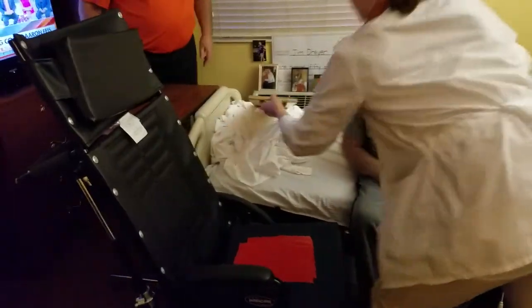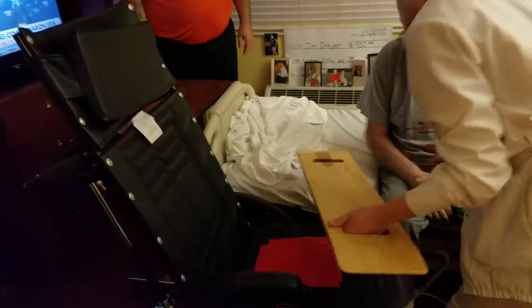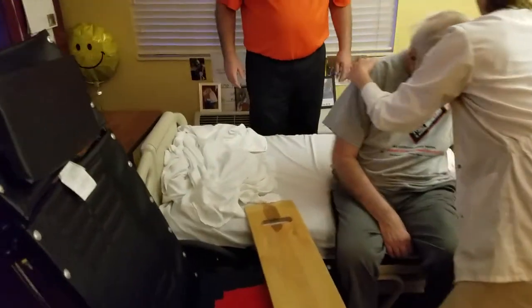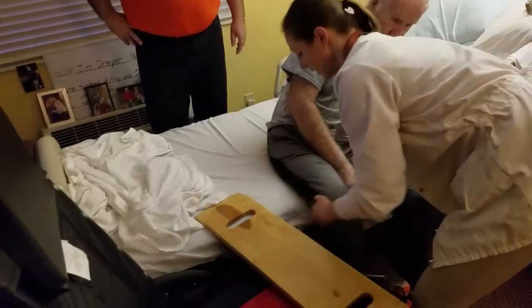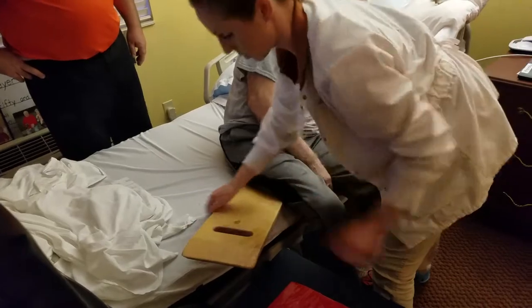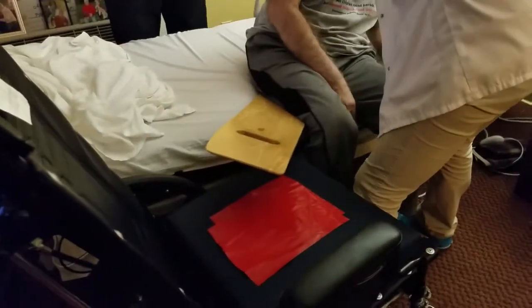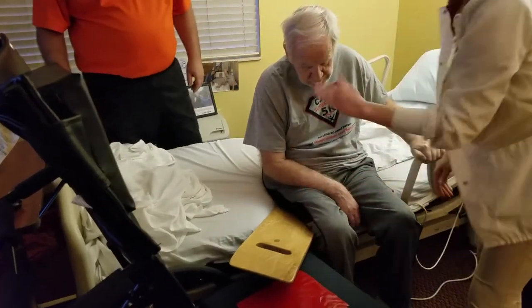Now it's time to put the board under. The board needs to be in this position, sliding it down like that. Mr. Dreyer, I need you to go back down on your elbow — all the way on your elbow. With him in that position, get some weight shifted, then you can pick his leg up and slide the board underneath. It should be angled, and you might need to pull the chair a little closer.